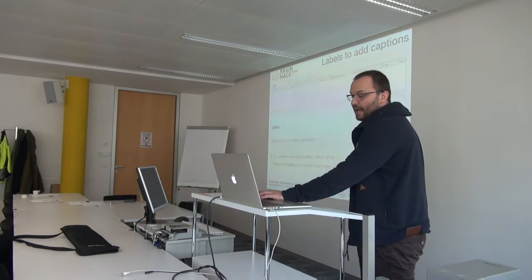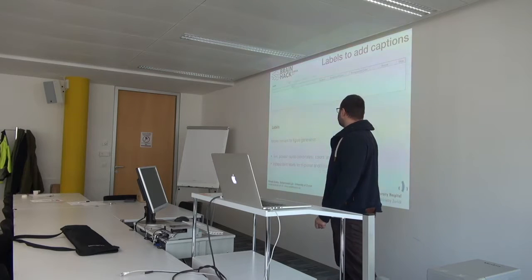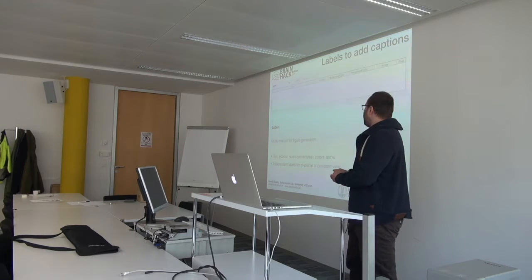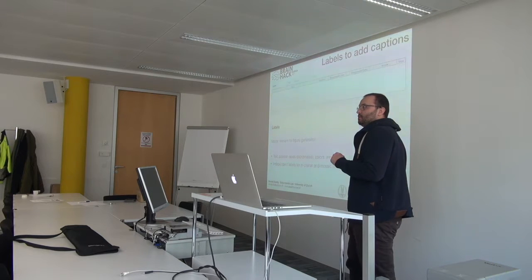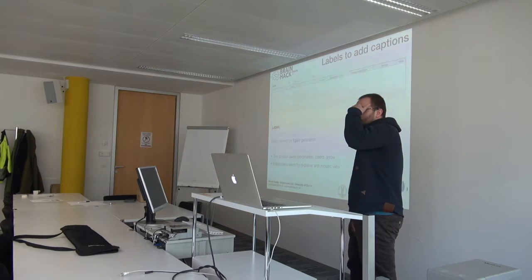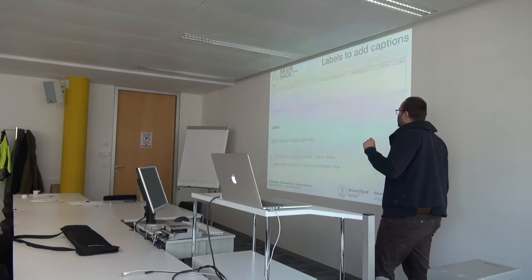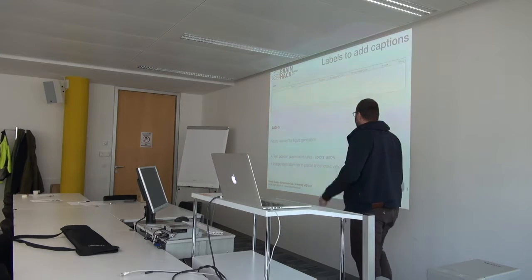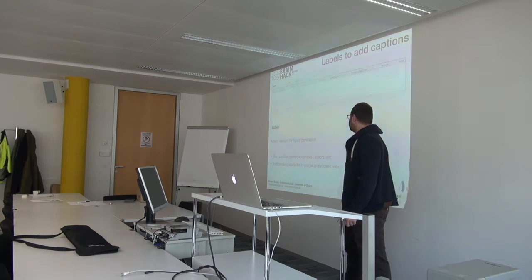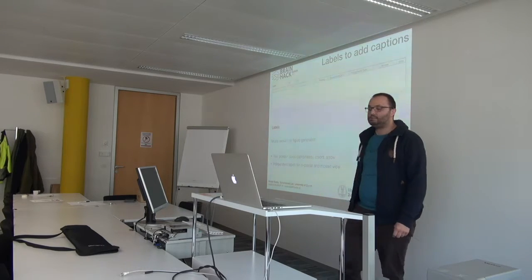The next section is labels. You can add text, specify the position — which is in axis coordinates relative to your figure, not voxel space — meaning when you move to different slices, the labels don't move with the data; they stay relative to the figure window. You can specify different colors and arrows, and you get independent labels for triplanar and mosaic views.